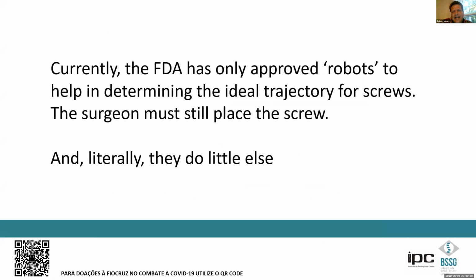But as it stands today, the FDA in the United States has only approved these devices to work with placing pedicle screws. So effectively, they become a helping hand, to help you place a pedicle screw using hopefully a navigation system as a backbone. And literally, they're not actually allowed to do anything else, at least in the United States.